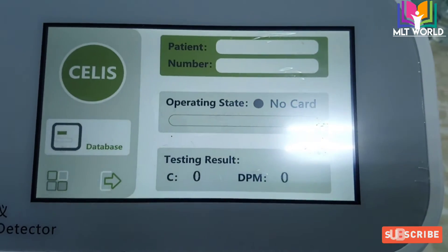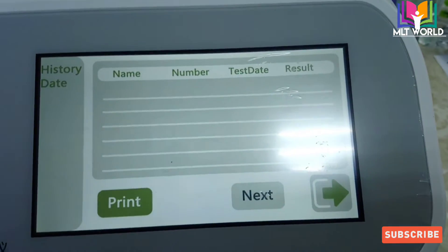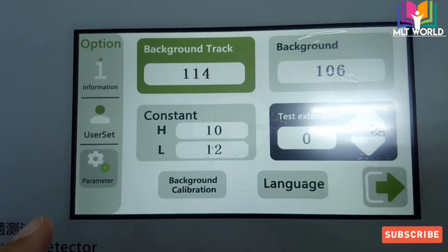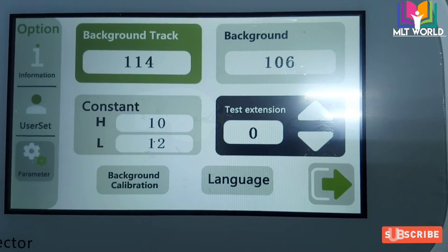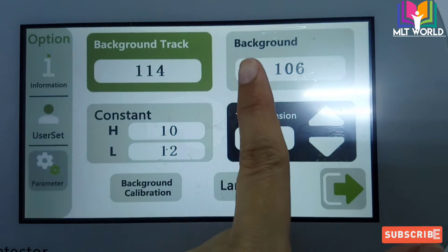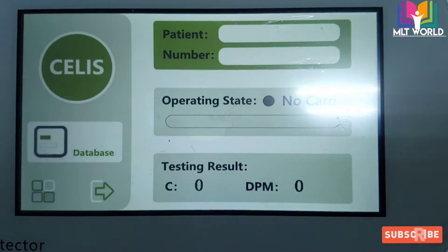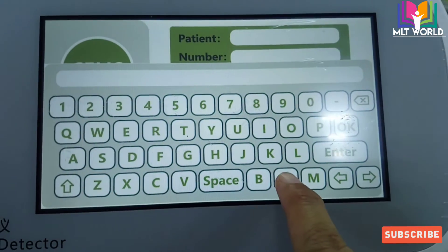Now this is the main screen when the machine is ready. In the database it will store the history of what tests were run. There is also a button to show the calibration. The background calibration is currently 106. If background calibration is more than 300, we will repeat the calibration. Now the machine is ready.